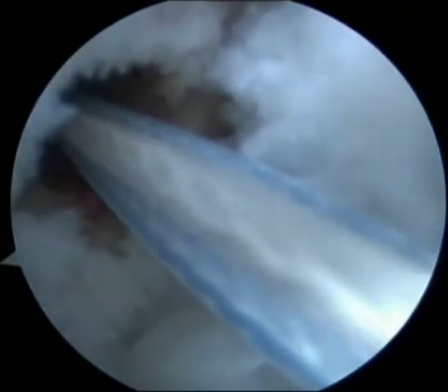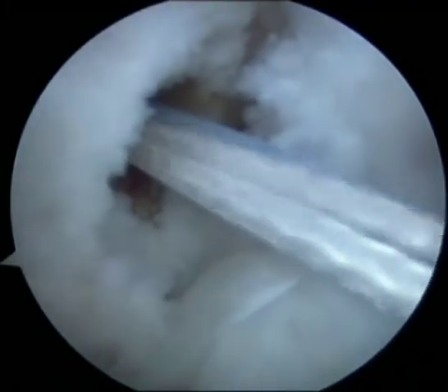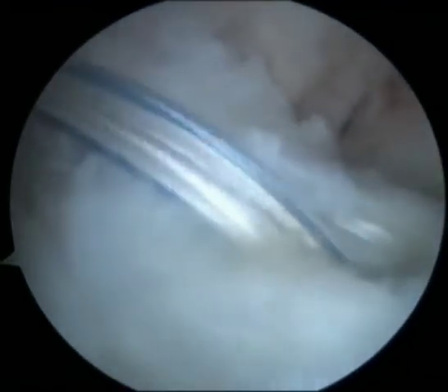The graft has been looped with the TightRope RT. The TightRope RT passing sutures are passed through the femoral socket and pulled from the lateral side under direct arthroscopic vision.